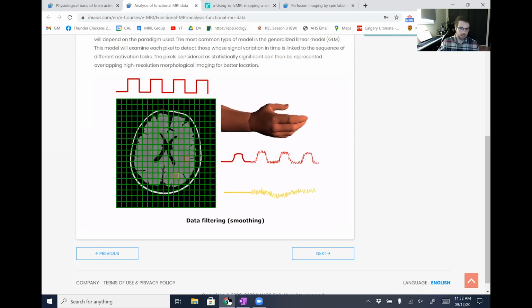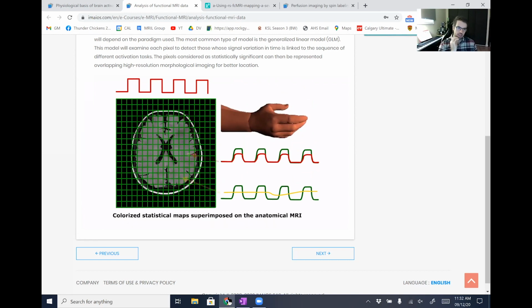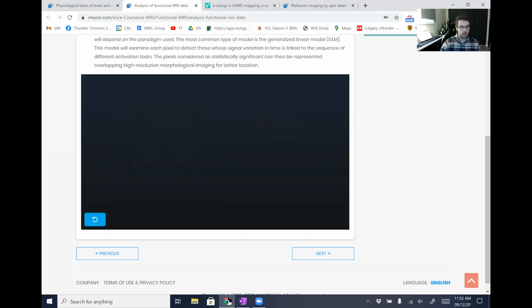And then, of course, we can see that before it's all smoothed out like it's being smoothed right now, the signal is quite noisy, just because, again, we're looking for differences in signal that are between 1 to 4 maybe percent in the tissue or in a region. So it's easy for those to be outweighed by noise. As a result, we're repeating this task a couple times here to make sure that we're seeing an increase in signal instead of just an aberration of noise.